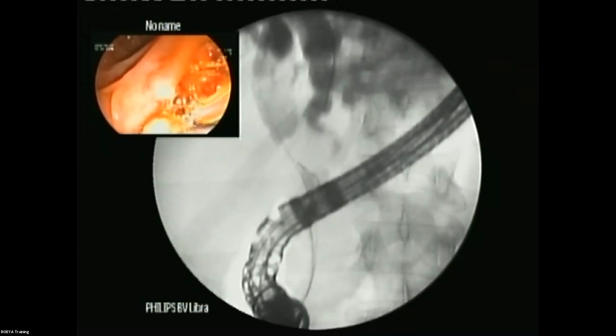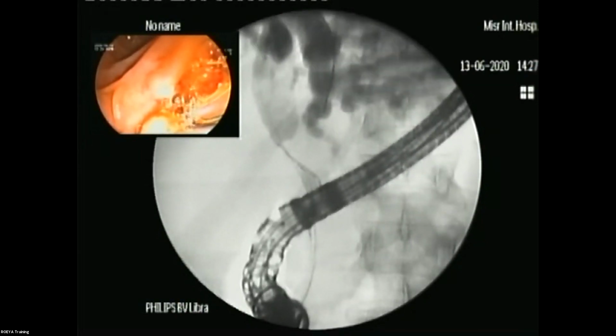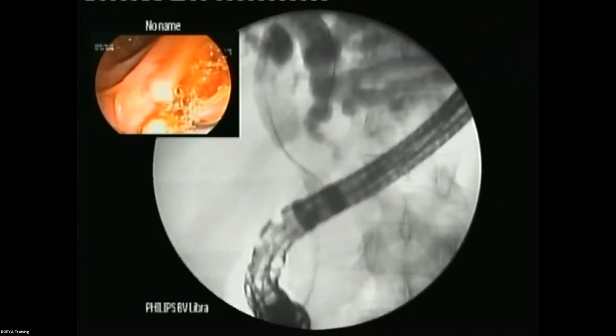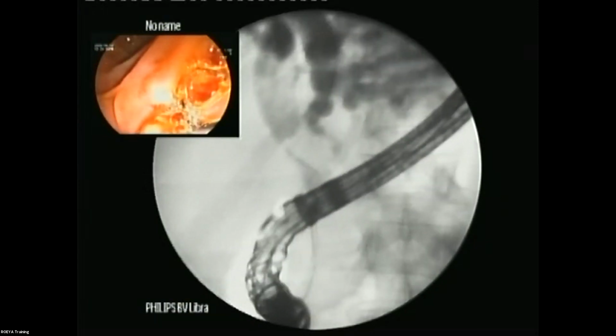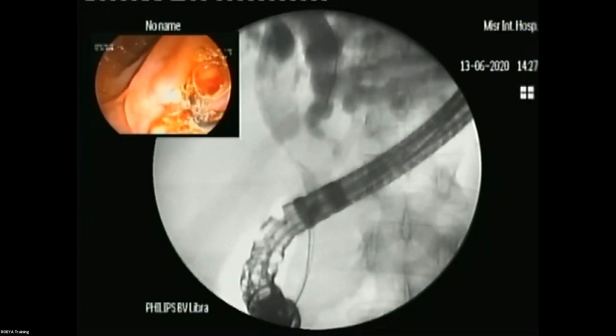So we entered the pancreatic duct several times. When this happens, I prefer to leave the pancreatic wire in place, and then with it in place, I use another guide wire to try to cannulate. This makes it easier because the pancreatic duct wire makes the CBD more straight and blocks entry into the pancreatic duct. So it's a very safe technique, right? Yeah, some people don't like it. I'm one of the people who really like this technique. It makes the cannulation much easier.